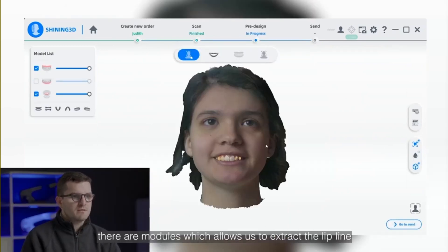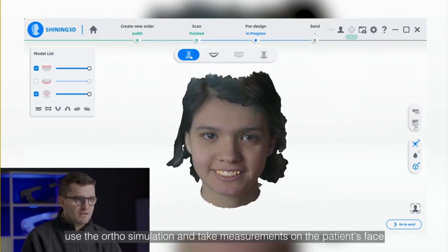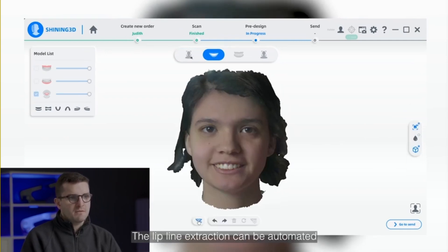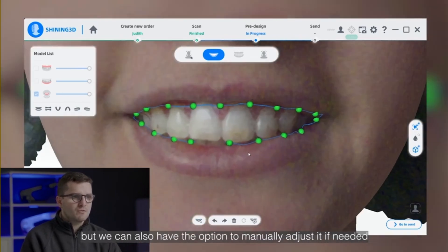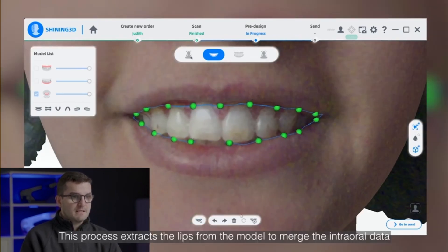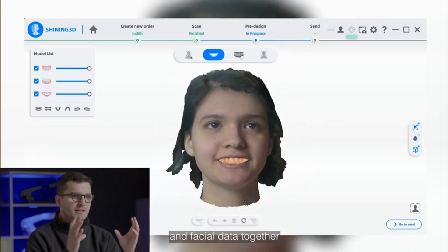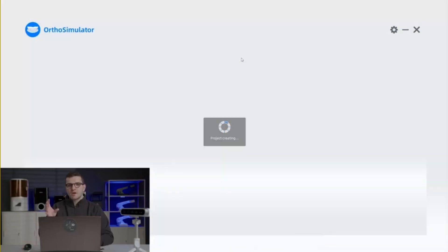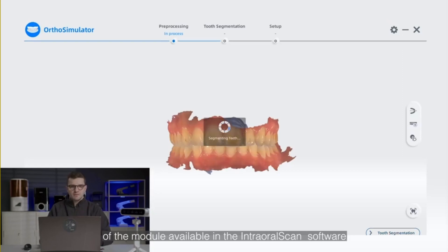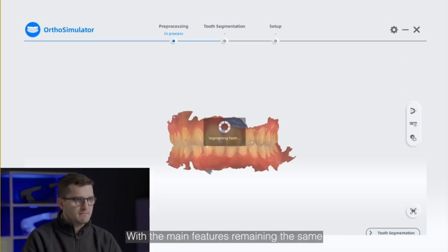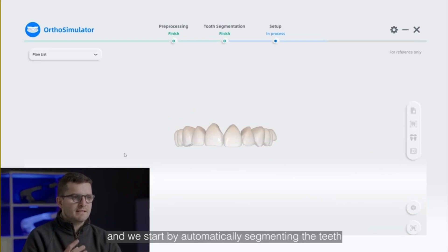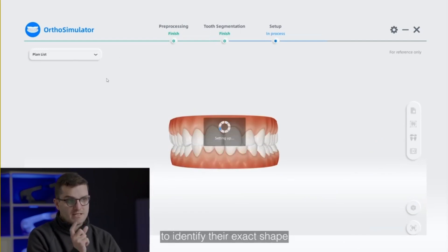Furthermore, there are modules which allow us to extract the lip line, use the ortho simulation, and take measurements on the patient's face. The lip line extraction can be automated, but we also have the option to manually adjust it if needed. This process extracts the lips from the model to merge the intraoral data and face scan data together. The ortho simulation is an updated version of the module available in the IntraoralScan software, with the main features remaining the same. Clicking on the ortho simulation initiates the process and we start by automatically segmenting the teeth to identify their exact shape.